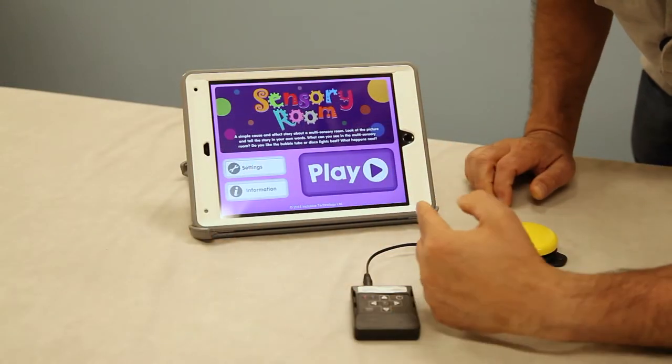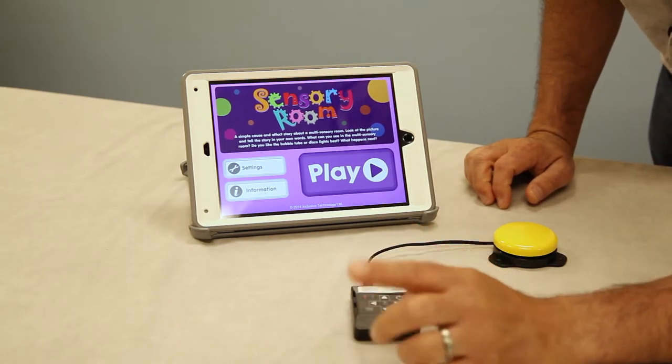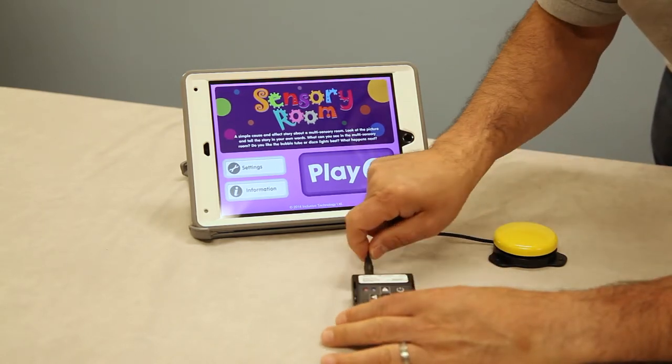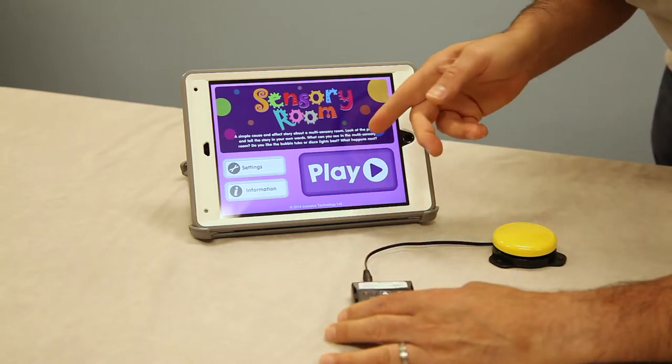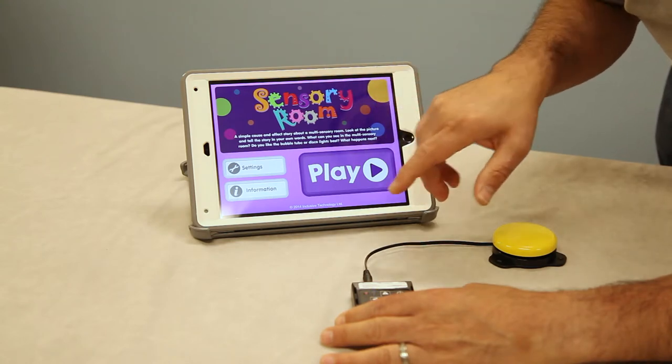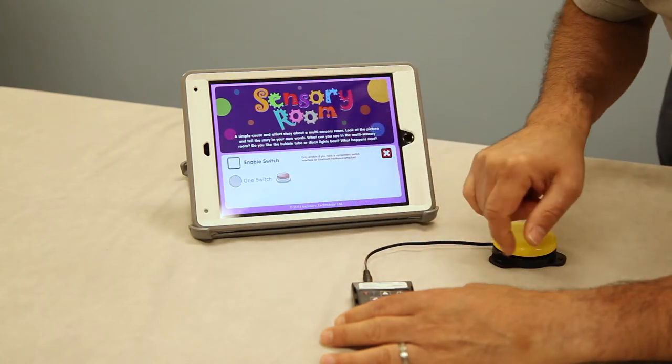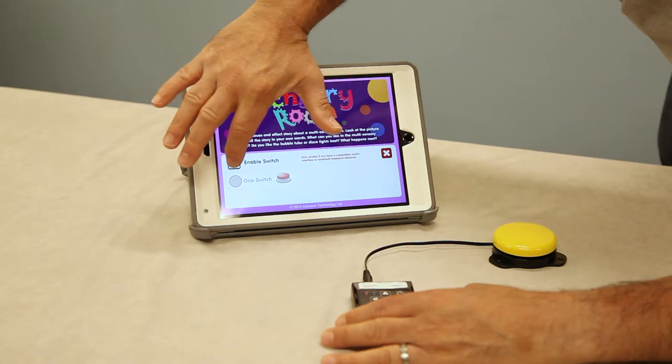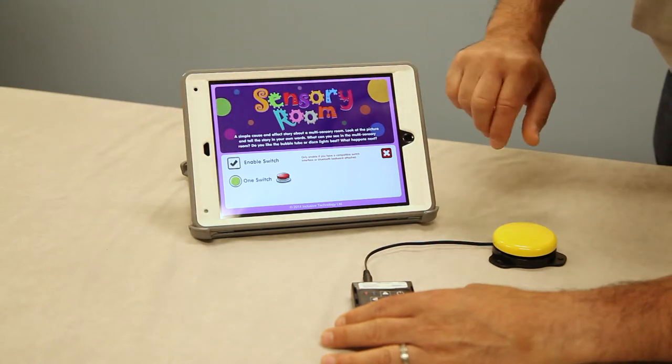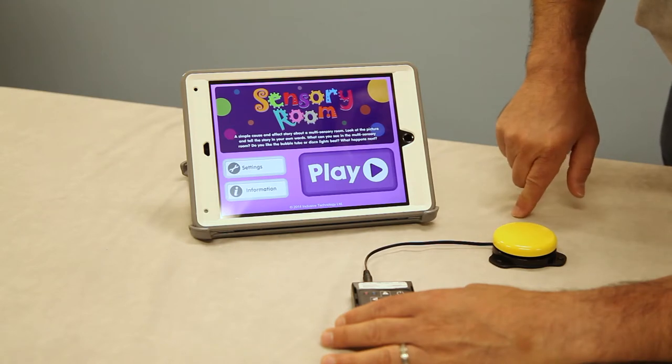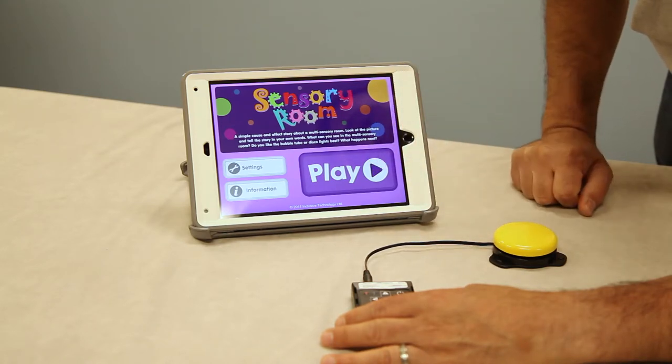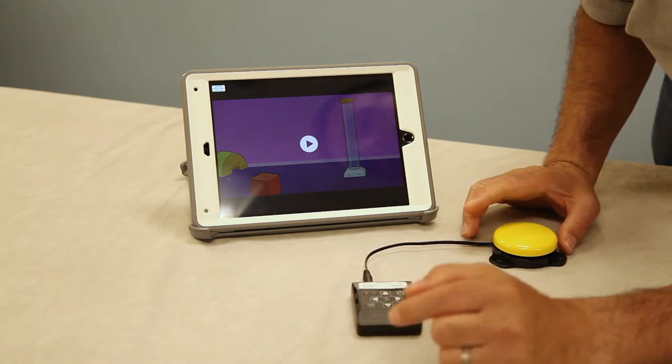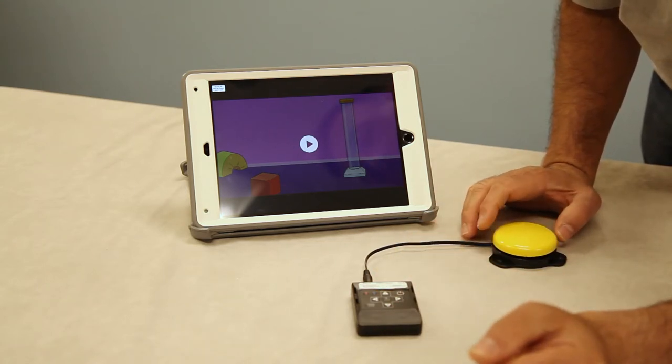So when we're going into this app, this is a very simple cause and effect that requires just one switch, and then for a single switch you always just plug into port number 1-2. When you enter the app, every app is a little different, but this one's going to ask you to check settings and we're going to be using an assistive switch so we want to enable the switch. And then we can click X that out and hit play. So every time I hit my switch it's going to do another function.